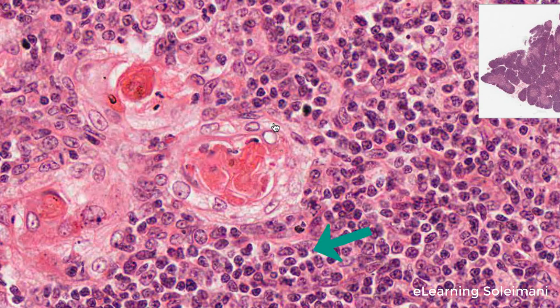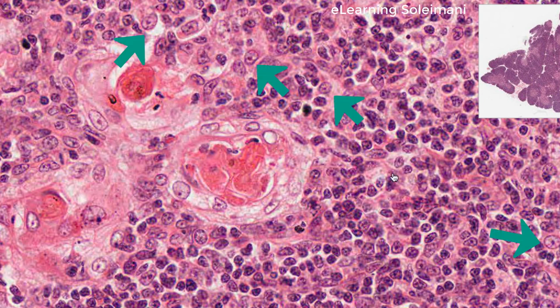The main cells of the thymus are the lymphocytes that migrated from the bone marrow, and the thymus stroma is comprised of the epithelio-reticular cells. Therefore, the thymus has a dual embryonic origin. There are no lymphatic follicles in the thymus, since the thymus doesn't ever get exposed to antigens. The lymphocytes are situated near each other as aggregates, but never form a follicle.